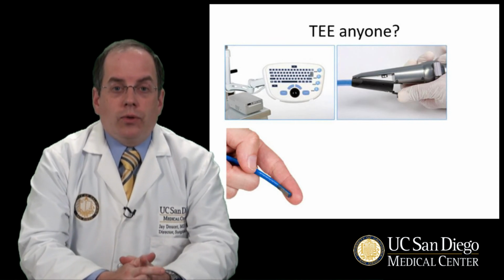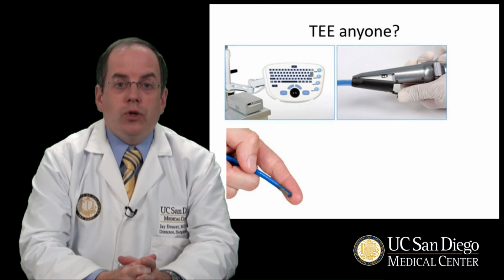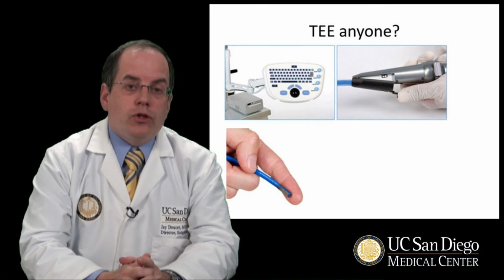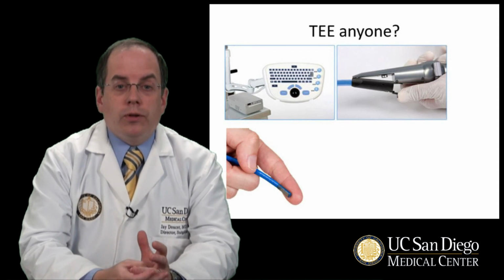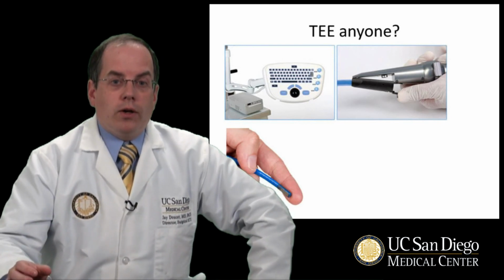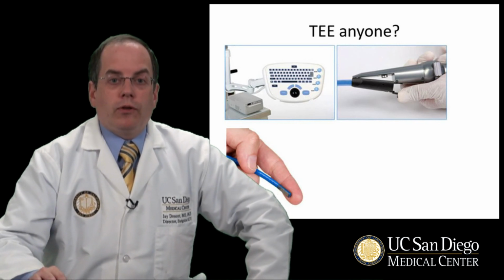This device is currently on the market. It can be used like an NG tube and kept in place for up to 72 hours after surgery, and the patient can undergo continuous or repeated measurements of ejection fraction as long as someone is there to pull the probe into the right position. By continuously or frequently using the short axis view, it is possible to look at cardiac performance in a way that's probably more meaningful to most of us than the use of the Swan-Ganz catheter.